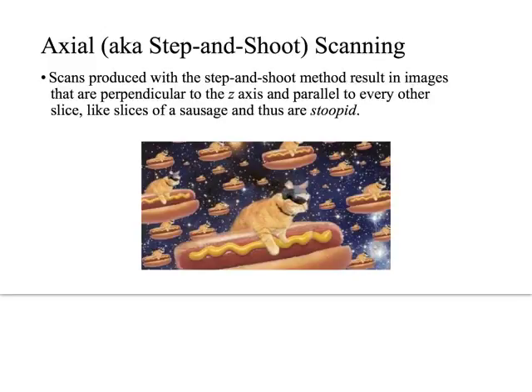One of the main reasons that they're stupid is they cannot be used for fusion. So these images are completely useless for PET-CT fusion. These images are completely useless for radiation therapy planning. These images are completely useless for 3D reconstruction.